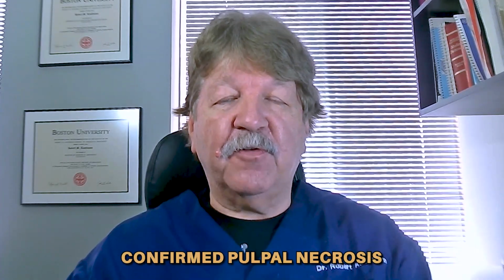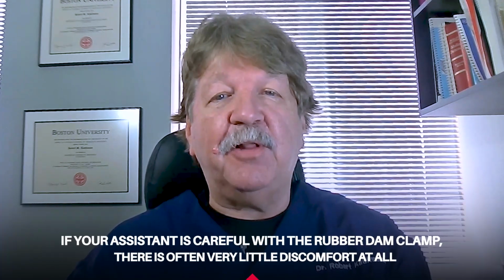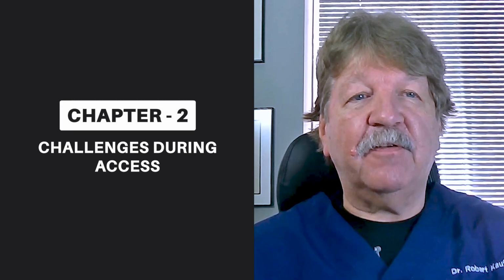In non-vital anterior teeth with radiolucent areas and confirmed pulpal necrosis, patients are astonished that I can perform treatment without anesthesia. It certainly is a great practice builder, and if your assistant is careful with the rubber dam clamp, there's often very little discomfort at all. This patient elected to go without a local anesthetic, and I attempted to make access through the crown.